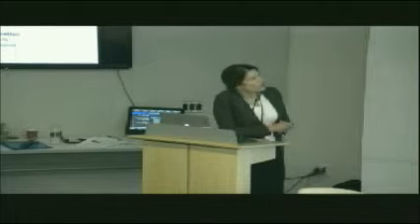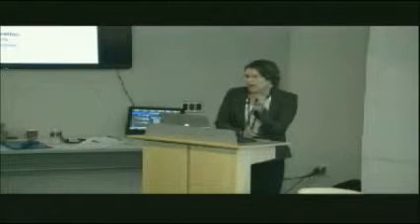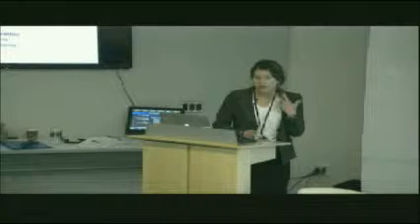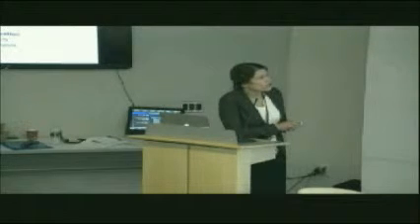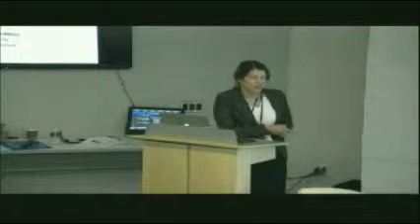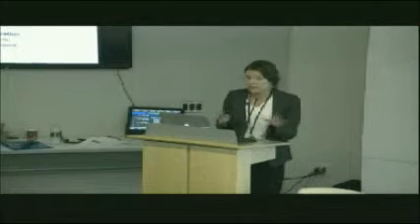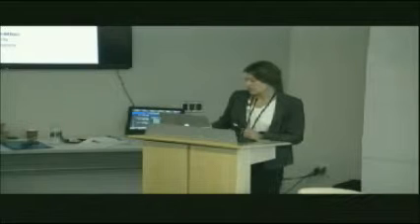Now, TMS is used as a diagnostic tool, and what we do is we measure, and we have all of these different variables that give us little pieces of information about how healthy the spinal cord and brain are. We also use it to evaluate therapies. So how plastic is the brain? Can we actually change behavior? So I'm going to define some of these for you. I'm doing it in a very general way, so if you have questions about specifics, I'm happy to take those, but I wanted to just get the main point across to you today.